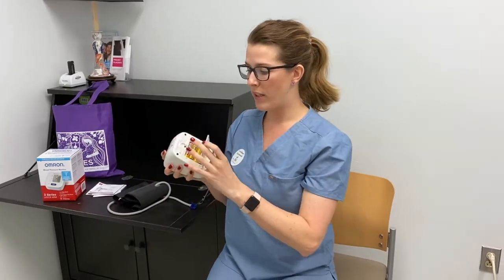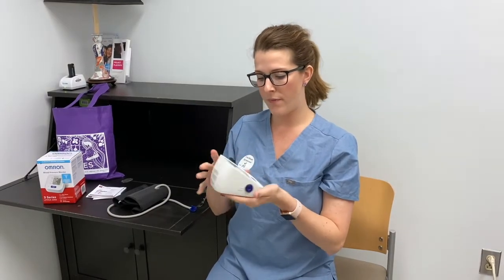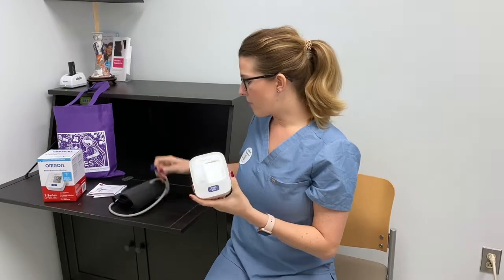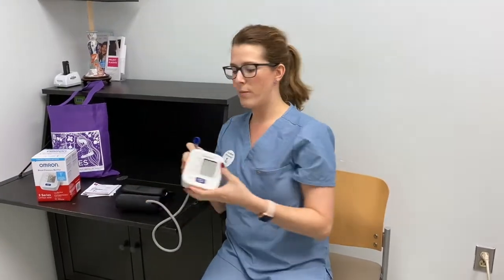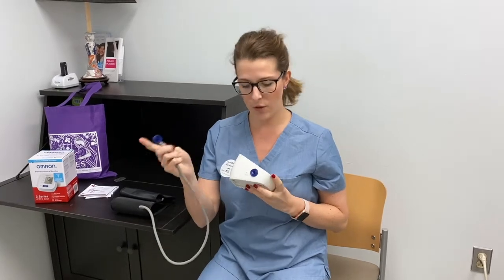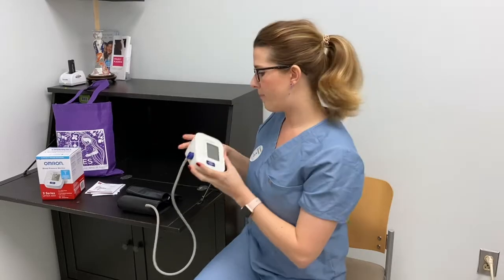And you have to put in 4 AA batteries for this to work. So you'll get your batteries and you put them in. And then the next step you have to do is to attach your cuff to the machine. So you'll see that this goes into this hole here and your cuff is attached.